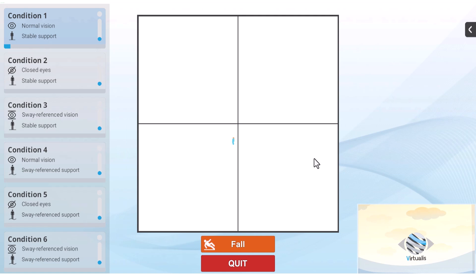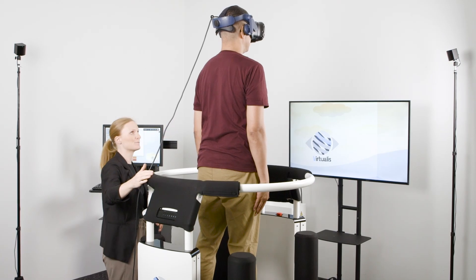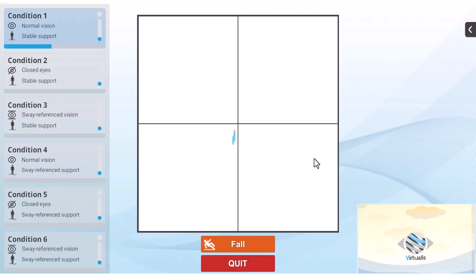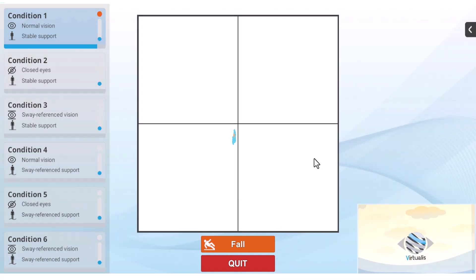The first condition is eyes open on a stable surface. The clinician can use the screen to observe real-time feedback on the patient's performance. If a patient loses their balance or moves their feet from the correct position, the clinician can press the fall button at the bottom of the screen and the trial will end.